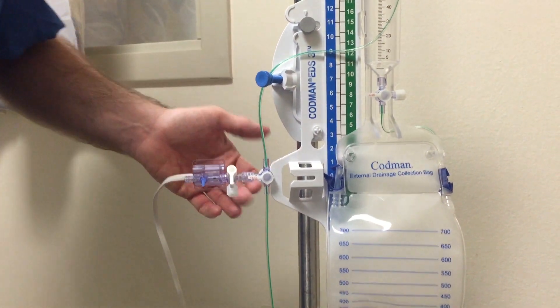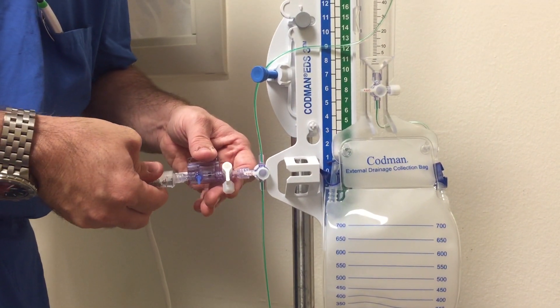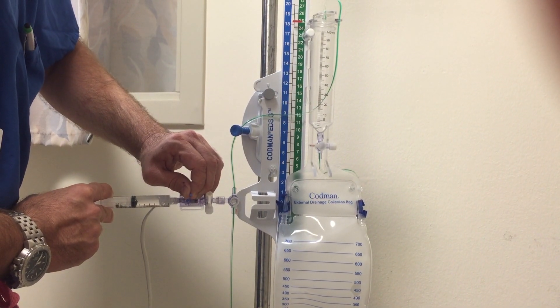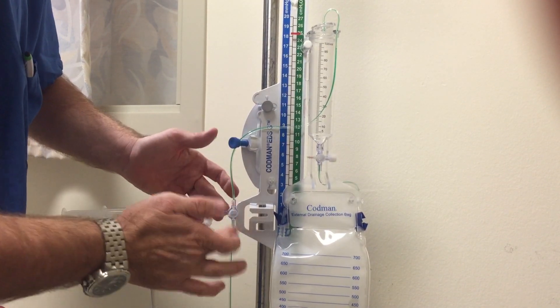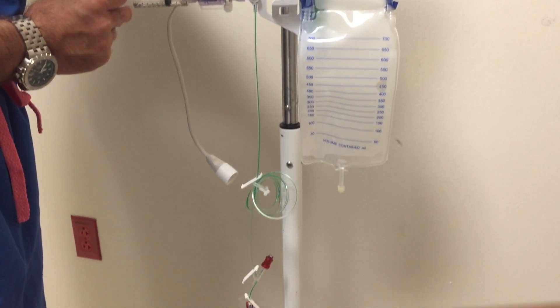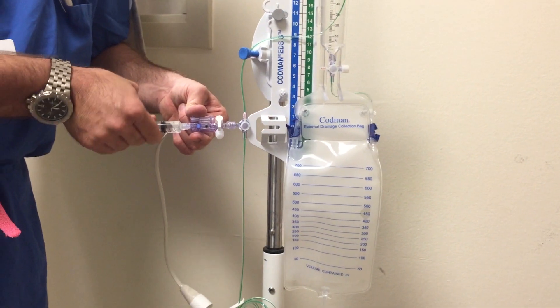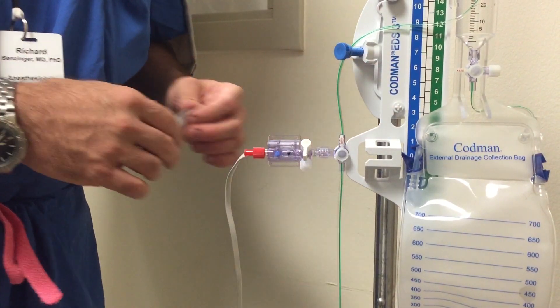To the back end where a pressure bag would otherwise go, we connect a 10-cc syringe full of sterile saline. To prime in an upward direction, I rotate the stopcock downward, pull the plunger, and then squirt until normal saline has filled that system. Then I rotate the stopcock upward to prime in a downward direction — again, pull the plunger, squirt some normal saline until the green tubing is filled. At that point, I disconnect the syringe and replace it with just a red cap. This is now a closed loop for transduction.